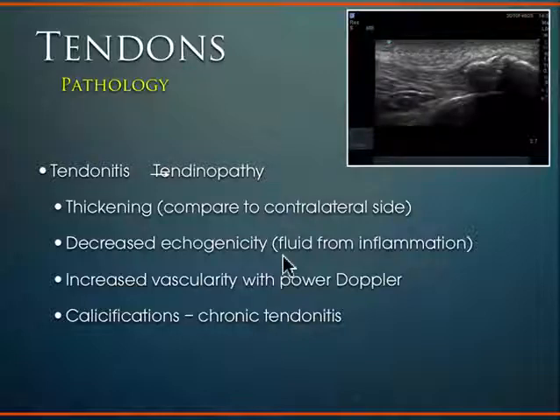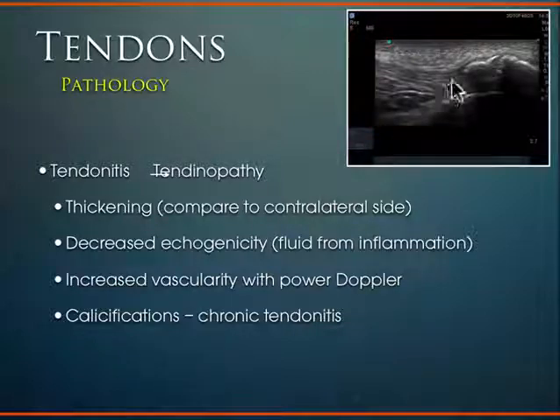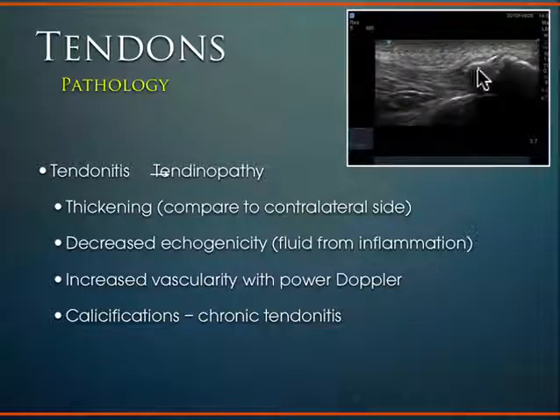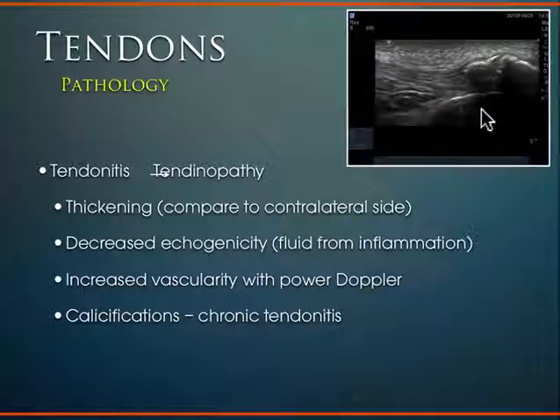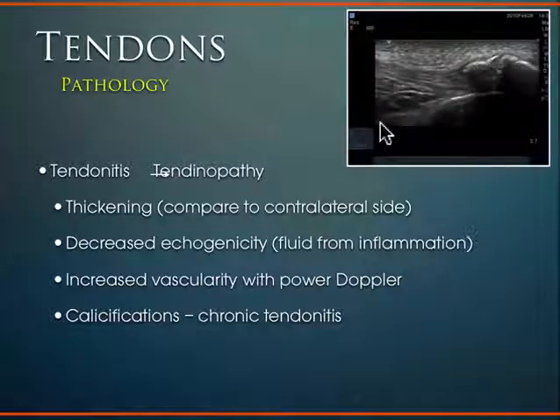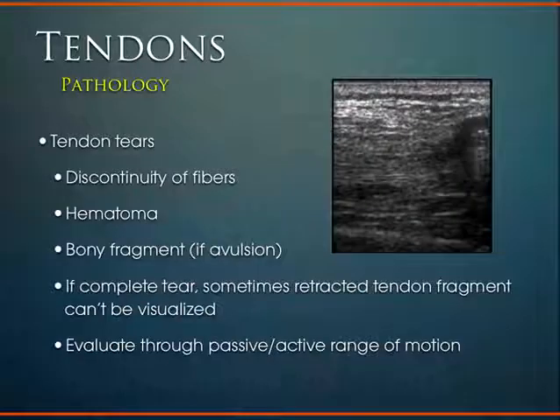We also hear about calcific tendonitis, typically in the shoulder rotator cuff muscles. The calcific changes you can see tend to be very thick hyperechoic structures. These are calcific changes within the tendon architecture, and just like bone, you're going to get a lot of deep shadowing below that very hyperechoic thick tissue because the sound waves don't penetrate through. You see nice normal tendon tissue coming across and then this calcific change — a nice example of pathology you can see.